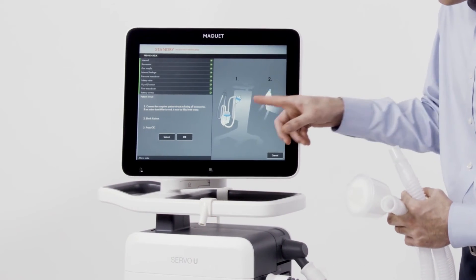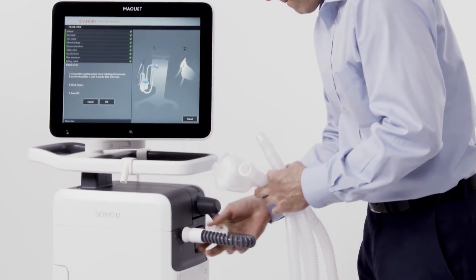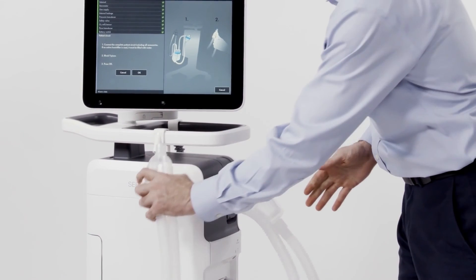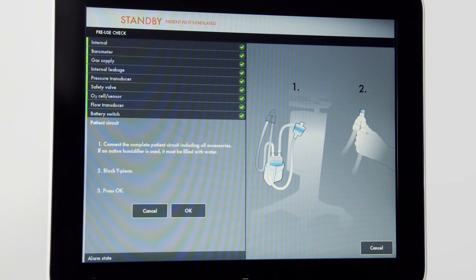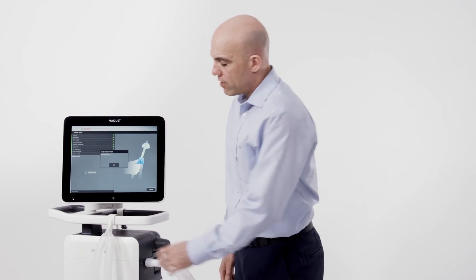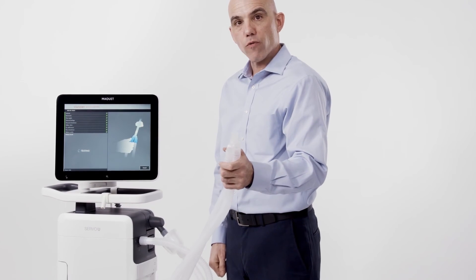Note on the screen step one. Step two is to occlude the circuit. Once the circuit is connected and occluded, confirm on the screen and follow the on-screen prompts. The circuit test will pressurize the circuit. Once pressurized, the final step is to remove the circuit from the occlusion and leave it open to room air.